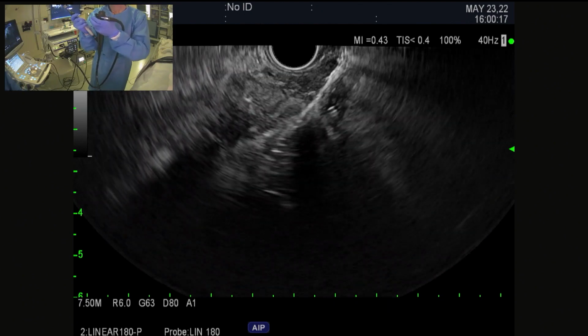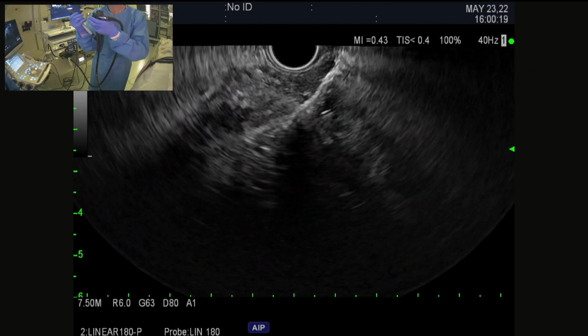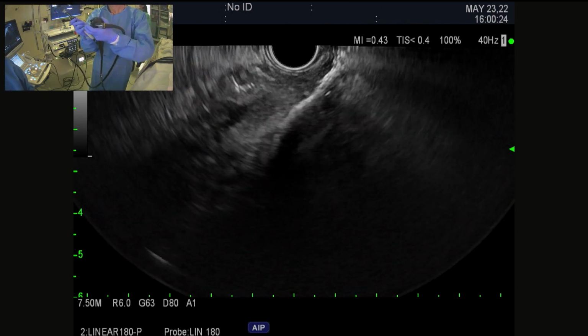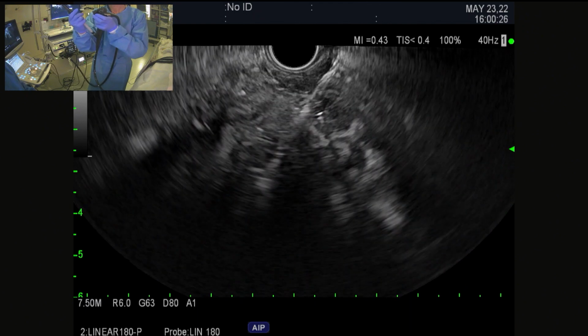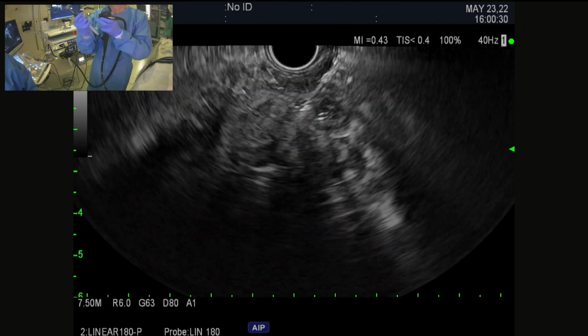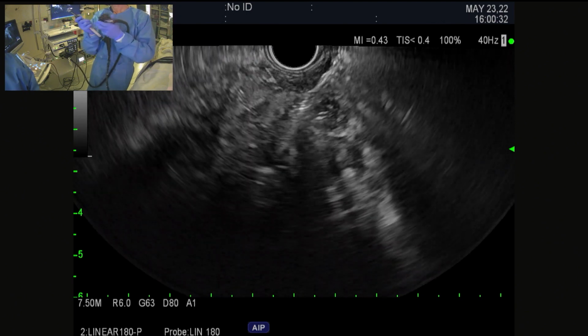See if I can see the flange better. Sometimes just back and forth, back and forth. Yes, exactly. Jiggle it, yeah, helps it open. You're starting to see a little bit of it. Ken knows a little bit about this stent.